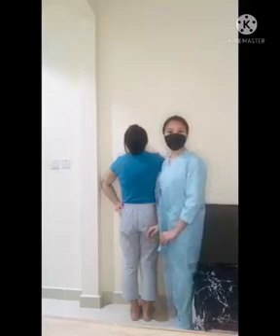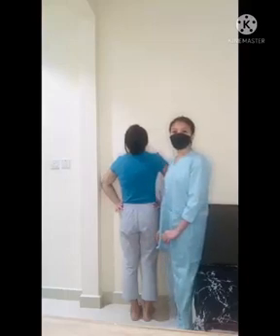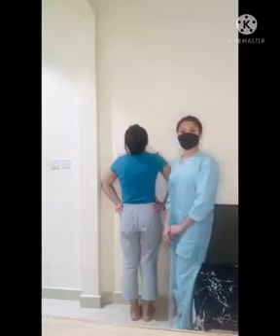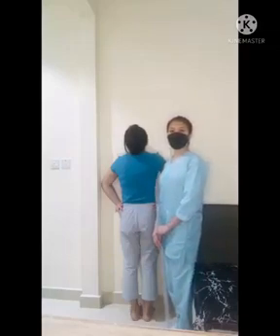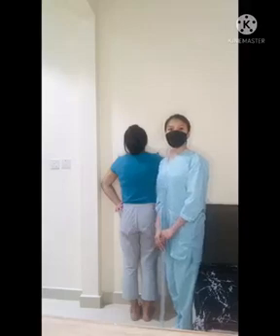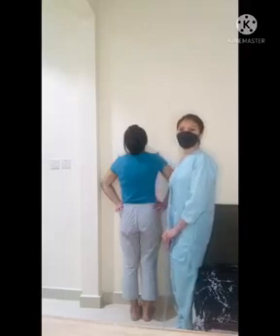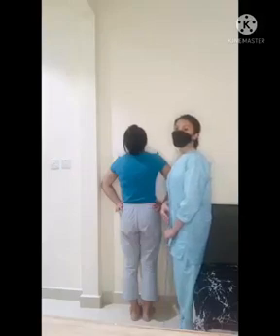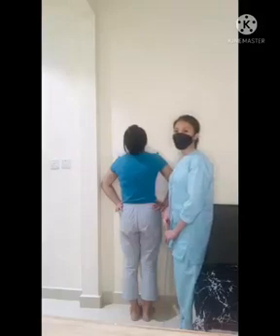Flex the elbow, then rotate the shoulders forward. Center the body to the midline of the IR, with the upper border of the IR placed 1.5 to 2 inches above the shoulder. Instruct the patient to suspend respiration at the end of the second full inspiration.